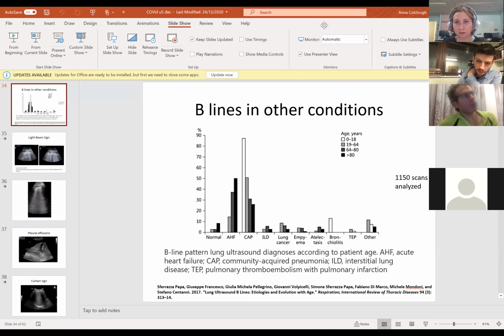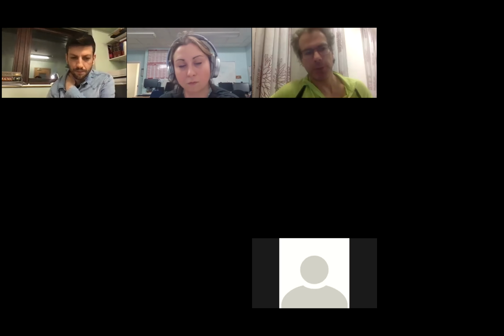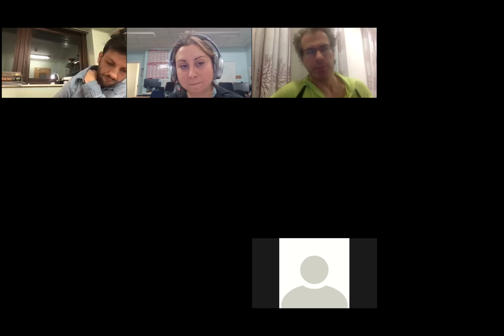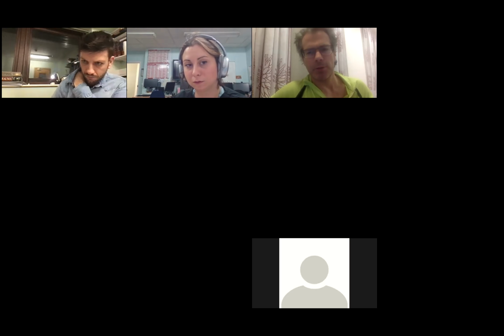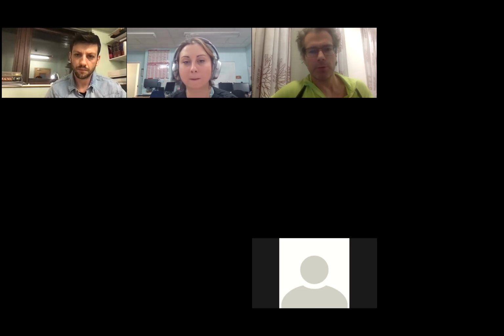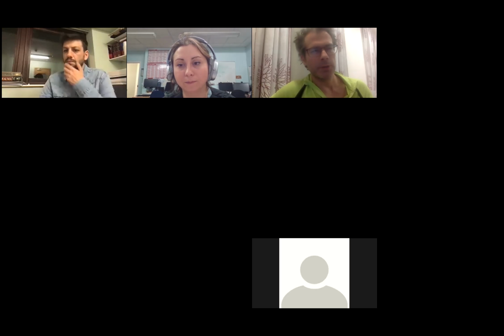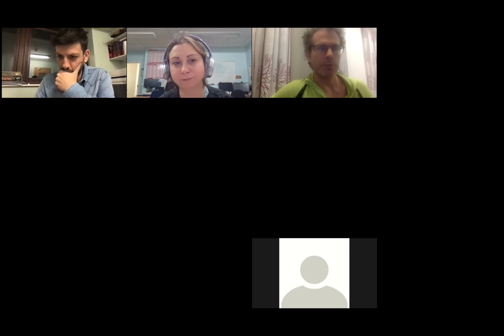Yeah, we're mostly using it for cases where the X-ray is normal or equivocal, as Ash was saying. And then if you see the classic COVID changes, integrating it with your pretest probability just to improve diagnostic accuracy. We thought about using it as a kind of streaming tool, but we decided not to because we've got quite good testing now. We're doing lateral flow testing and the point of care LIAT testing, so we get pretty quick answers from that. And so we didn't think it added that much in terms of streaming. So yeah, it's mostly useful.